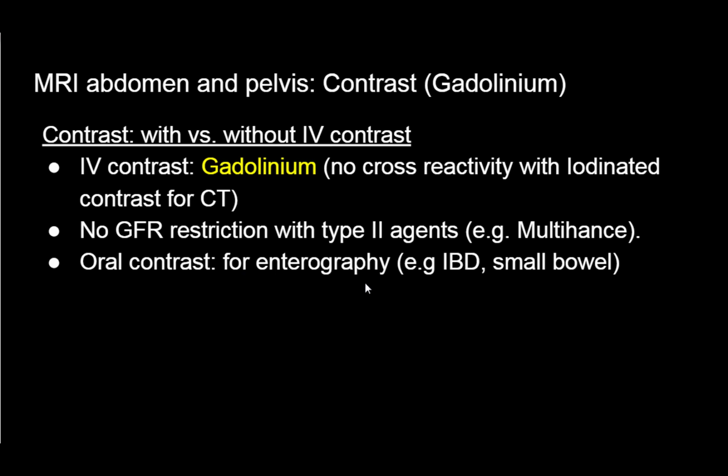If patients are acutely sick or cannot tolerate it, then of course you're going to do a CT. But for any young people, any individuals where you're trying to characterize Crohn's or IBD and patients are outpatients and not acutely ill or septic, then MR is preferred over CT enterography. So that's a summary of modalities used in abdominal radiology.